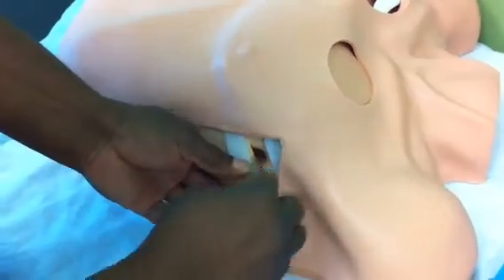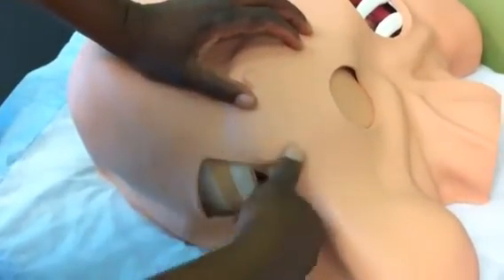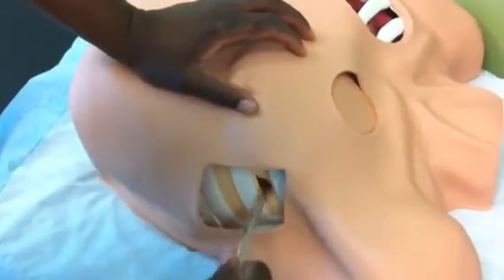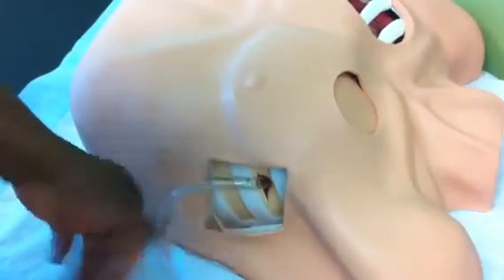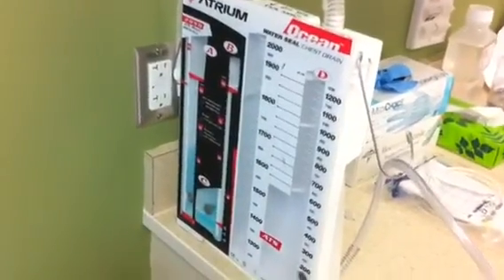At that stage, I tie the tube to the skin, make a good tie so it is really sealed. Then I put some dressing on it, tape it down, and connect the thoracostomy tube to the suction pump.